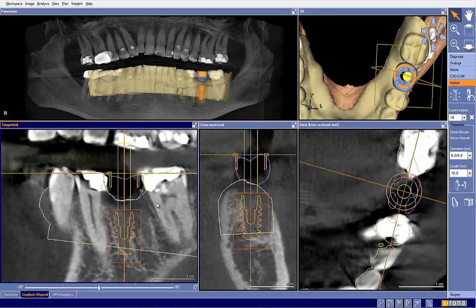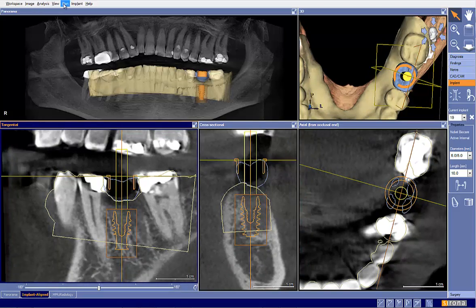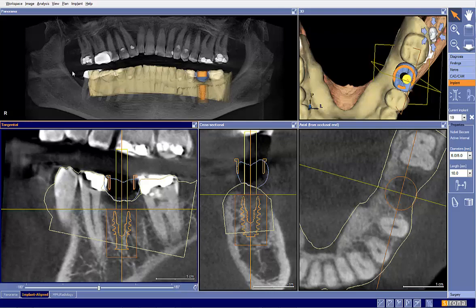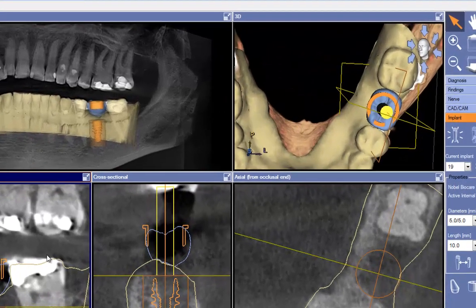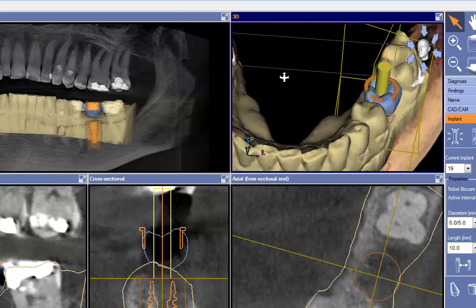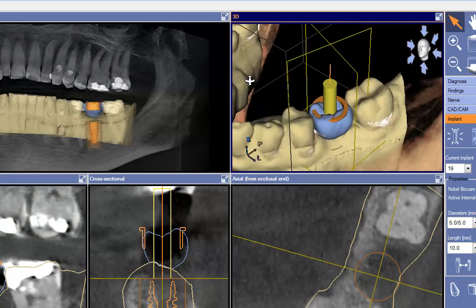So here's a slightly more idealized plan. If we compare that to where we started, the only main difference, to be honest with you, is just the occlusal plane being a little bit more up and down than I would like it to be. So let's try to get it more level.